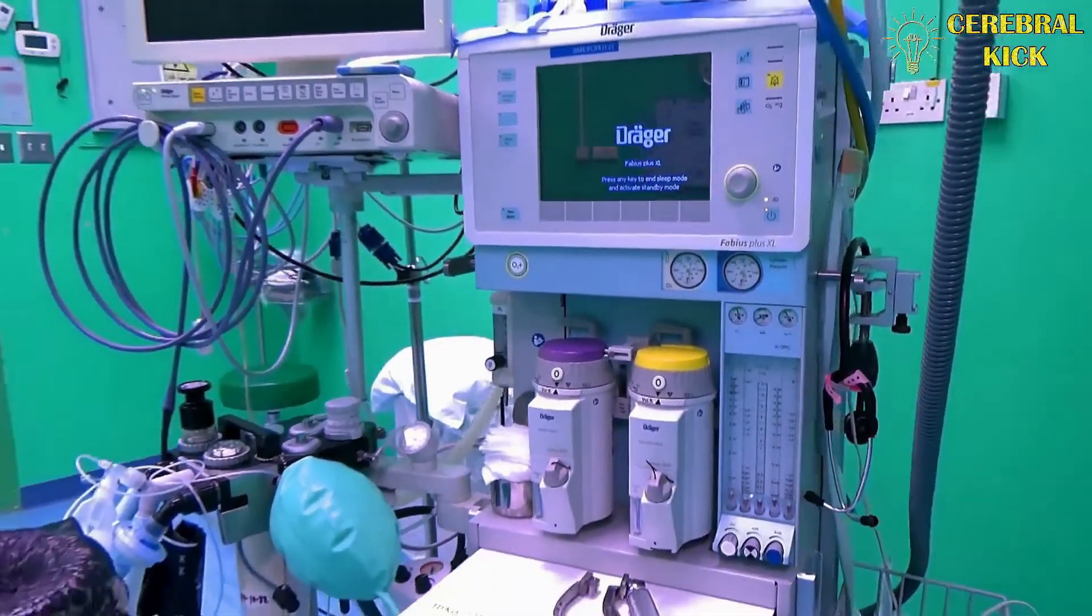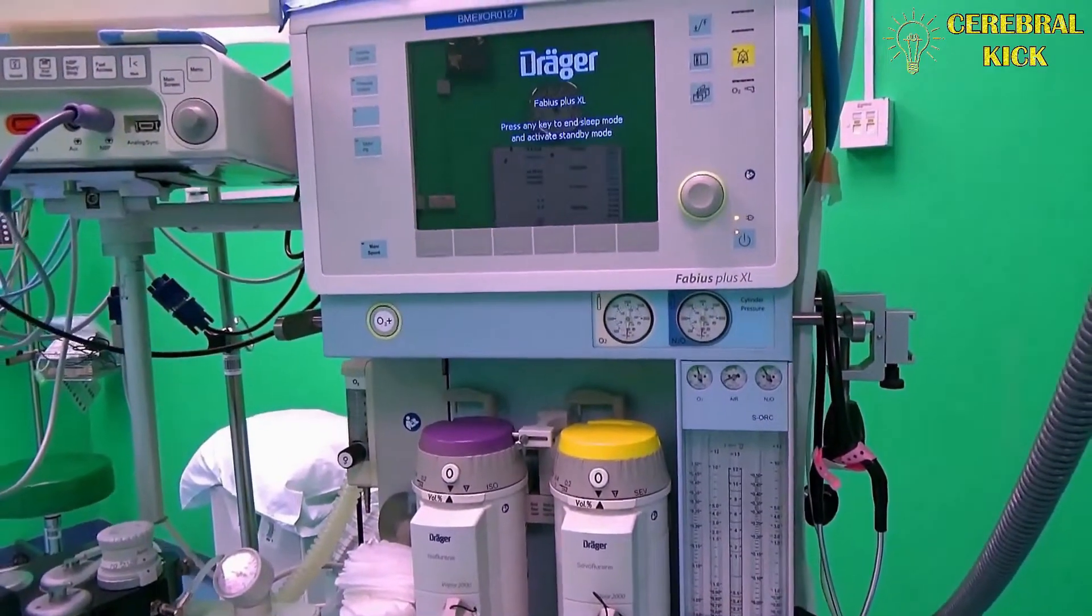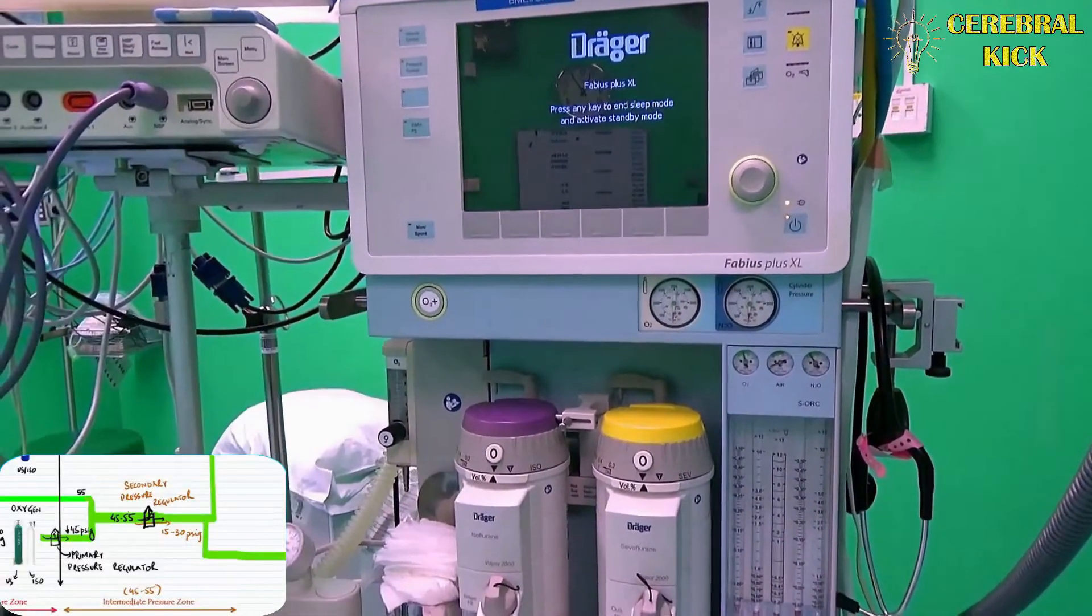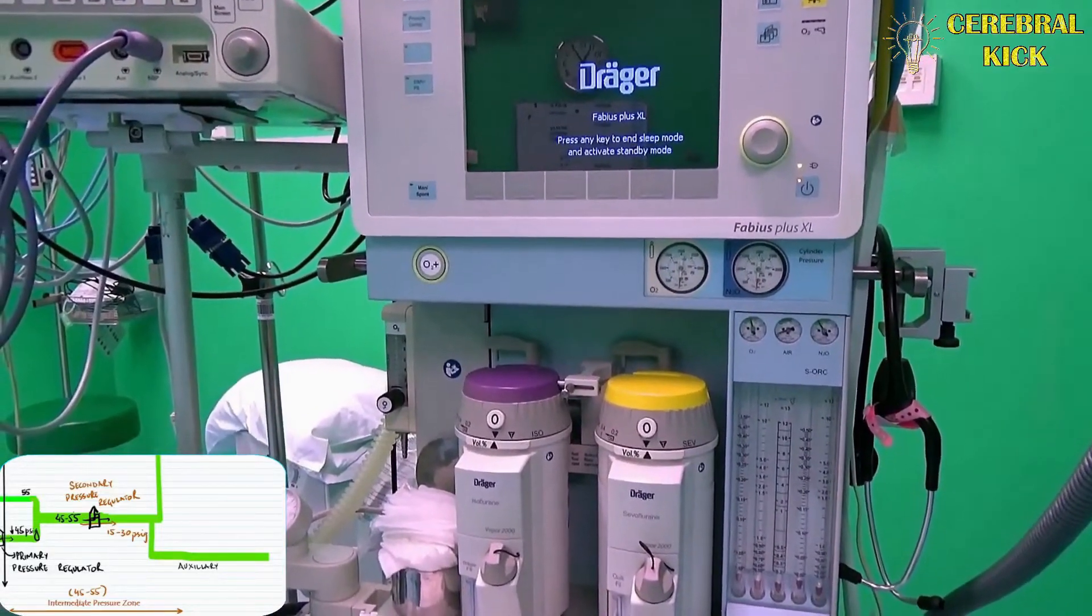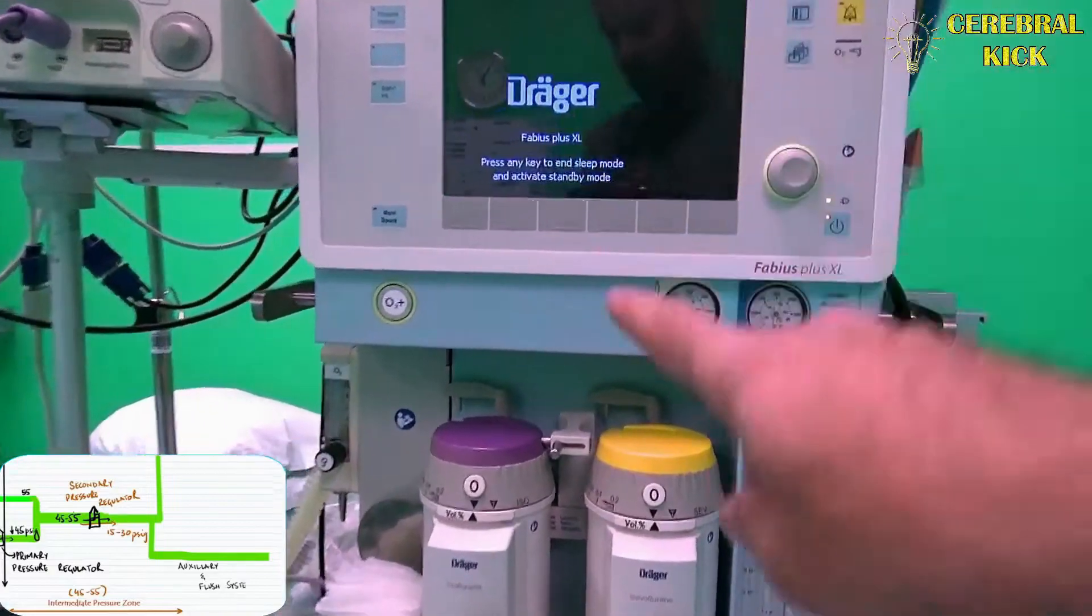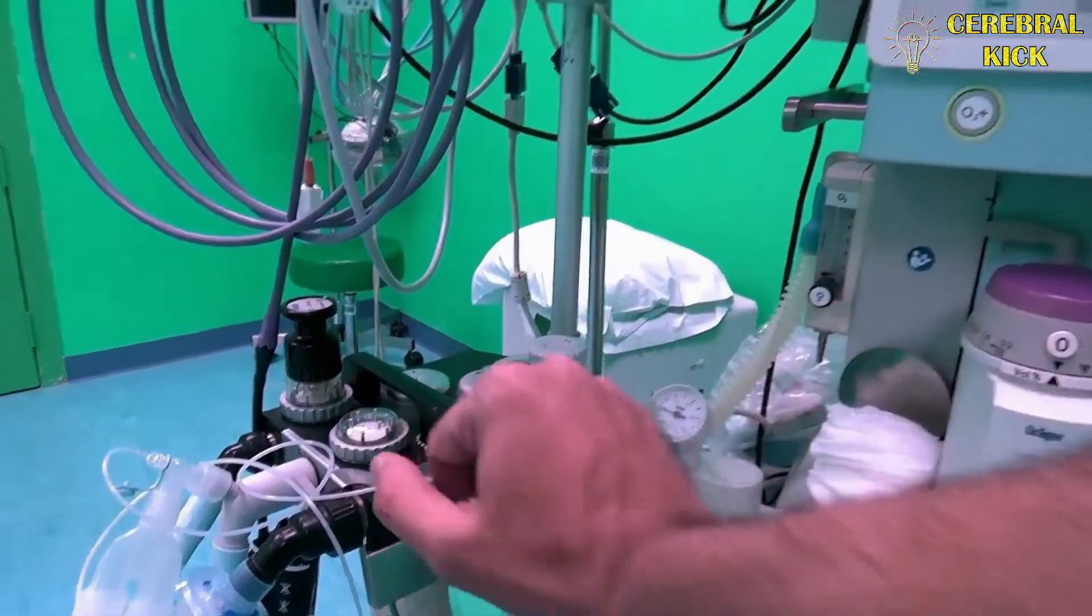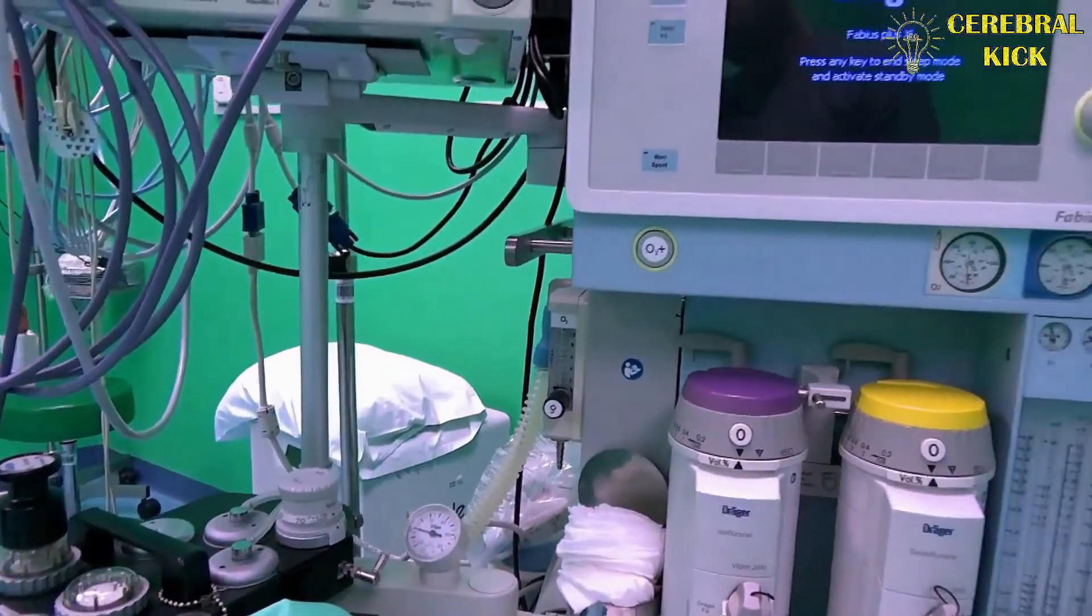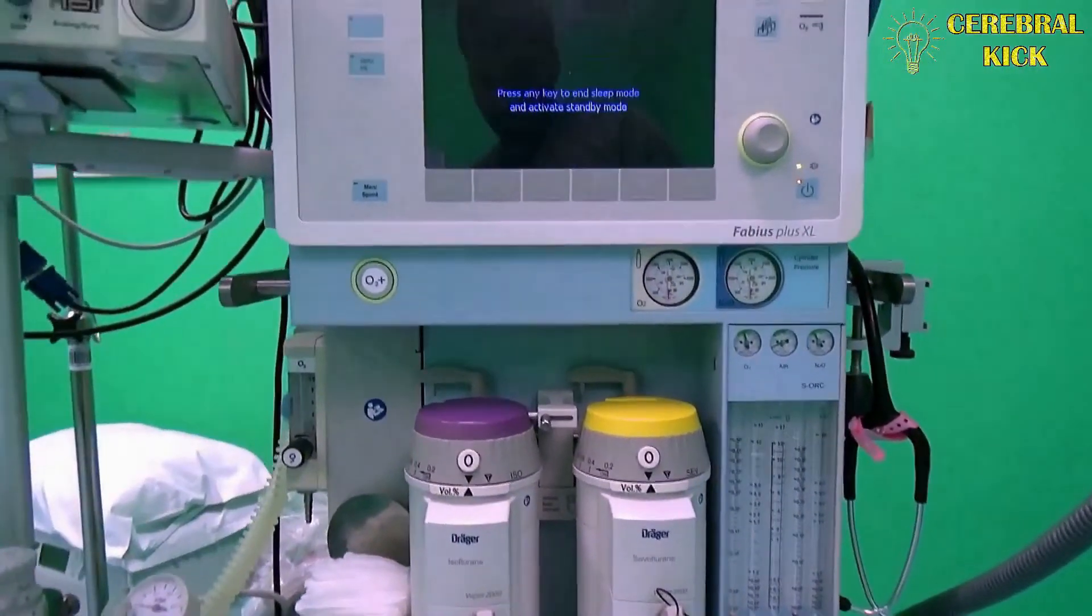We discussed that in the intermediate zone, the oxygen pipeline divides and it gives off a branch to auxiliary oxygen port and the oxygen flush, which bypass the low pressure zones and go straight to the breathing circuit here somewhere. There are those oxygen flush ports or the auxiliary oxygen ports - it's located right in the front.